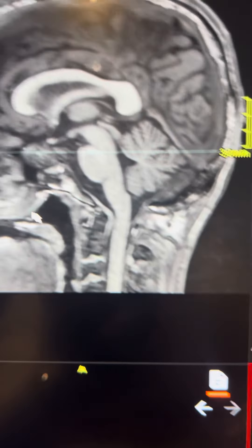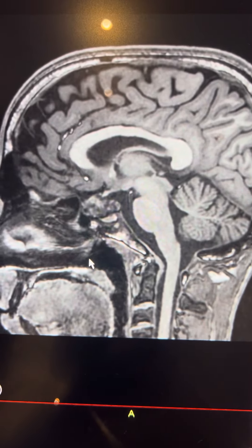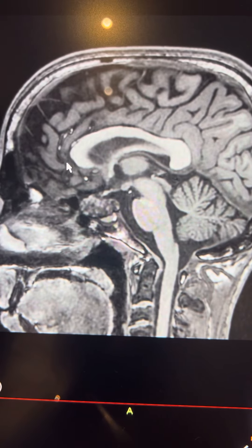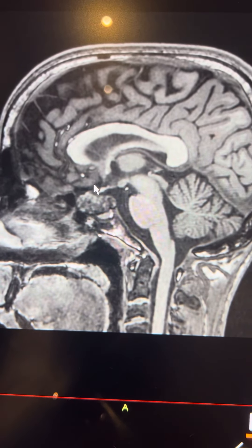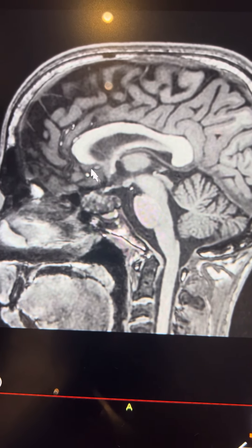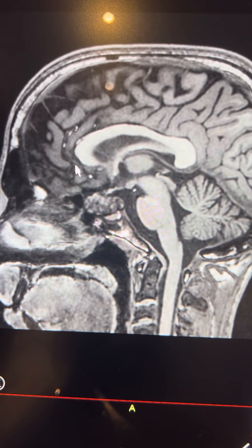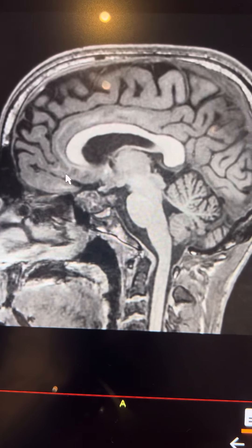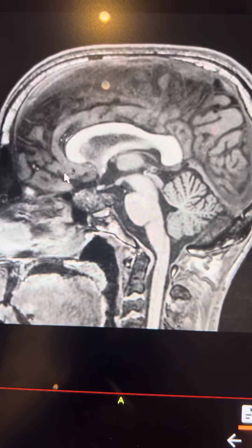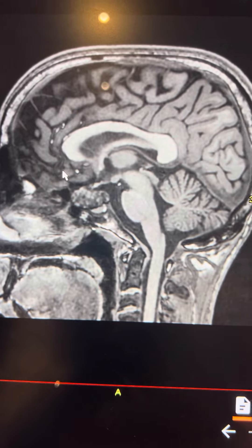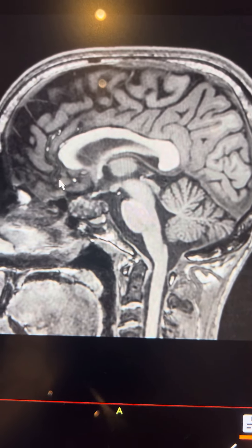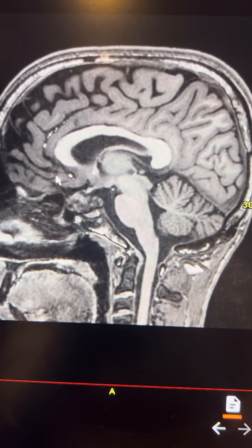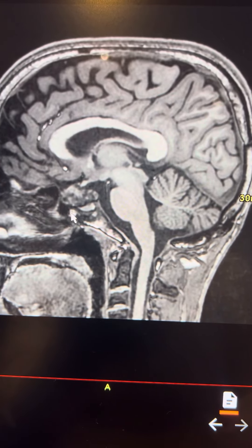What's interesting is that separate from that, we could see some areas — small dots of bright signal in the subarachnoid space, separate from the main lesion. So this is a typical appearance of a ruptured dermoid cyst, because we see subarachnoid space hyperintensity.